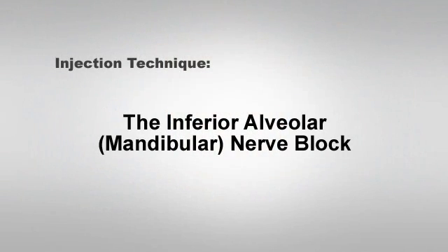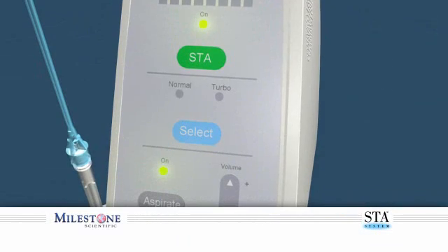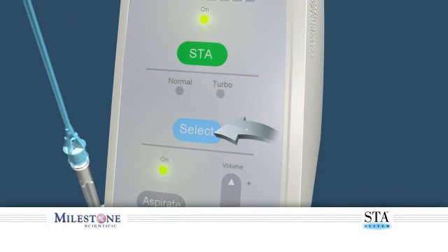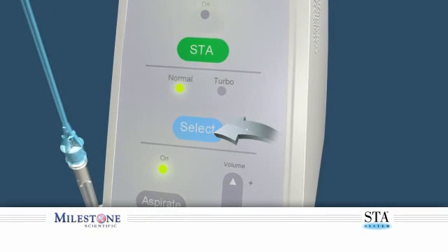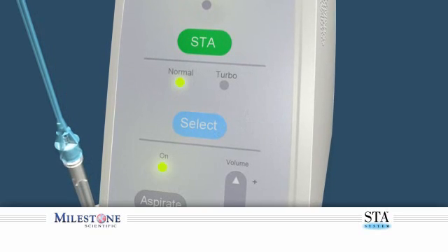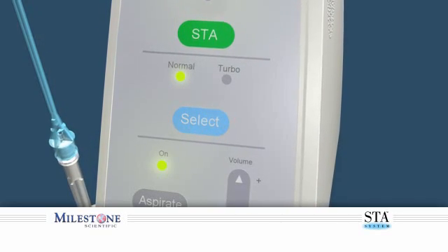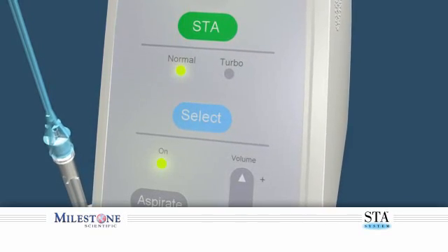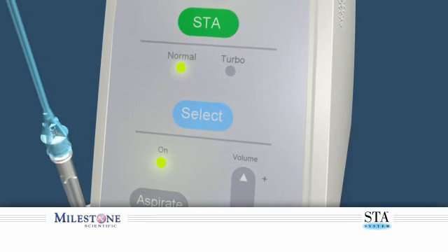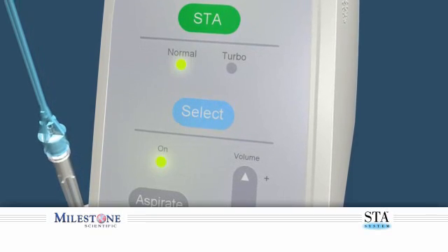Injection Technique: The Inferior Alveolar Mandibular Nerve Block. Let's discuss how to begin. Set the STA system to the normal mode, which allows the STA system to function with two distinct flow rates: the control flow and the rapid flow rate.